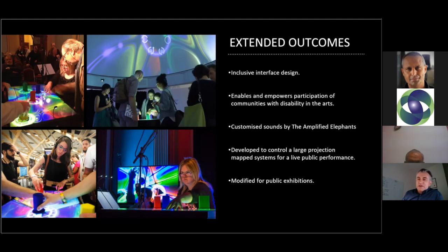And so through that process of engagement across many different communities and research domains, we've been able to refine and adapt the system into different contexts. The system has extended well beyond its original design, from clinical rehabilitation use towards an instrument for musicians with disability and professional performers.